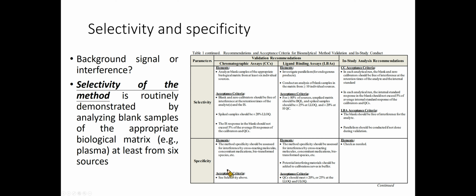For LC mass assays, matrix effects such as ion suppression, ion enhancement, or extraction efficiency should be evaluated. Internal standards should be assessed to avoid interference with the analyte. Potential interfering substances in the biological matrix include endogenous matrix components such as metabolites, decomposition products, and, from the actual study, concomitant medications and other xenobiotics.